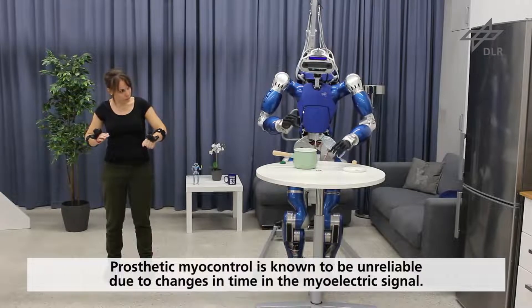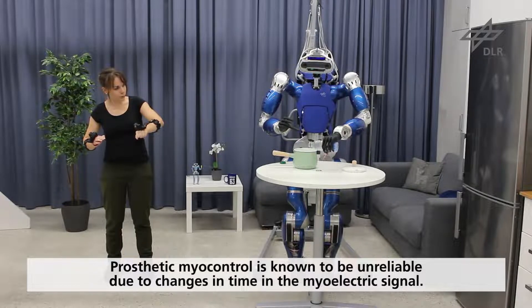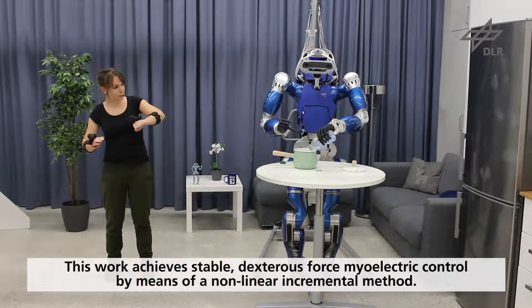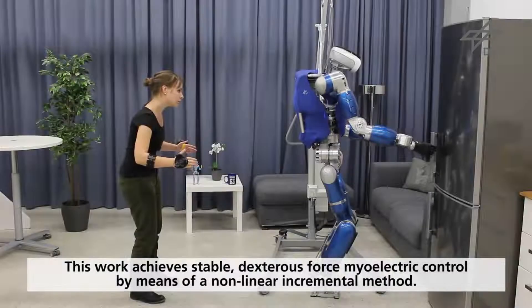Prosthetic myocontrol is known to be unreliable due to changes in time in the myoelectric signal caused by factors such as perspiration, electrode displacement, fatigue, and kinematic configuration of the arm. This work achieves stable, dexterous force control by means of a nonlinear incremental method that provides both accurate prediction and adaptation to changing conditions.